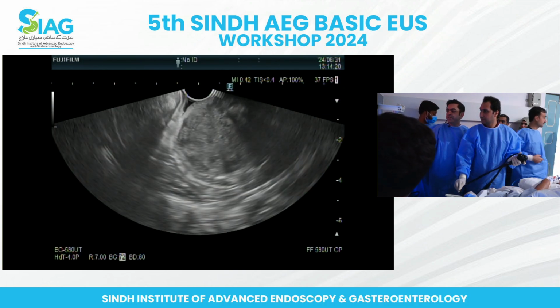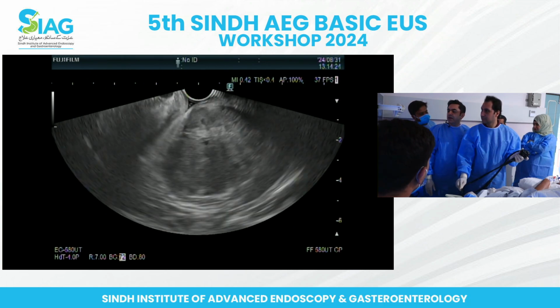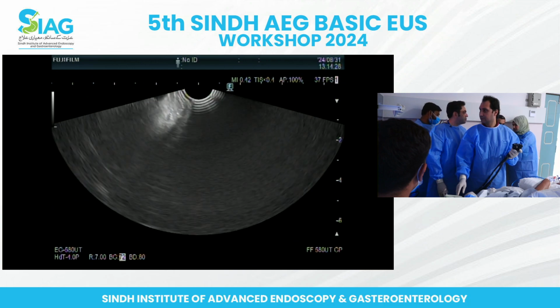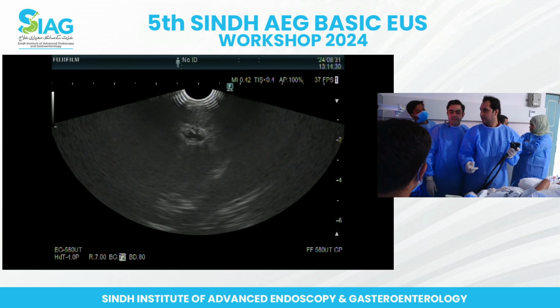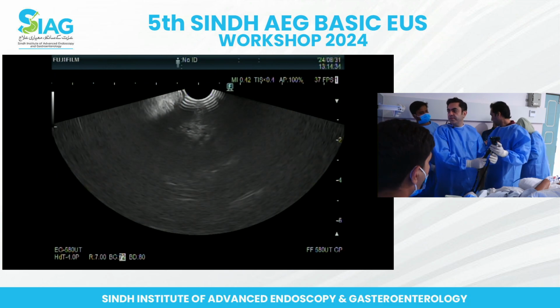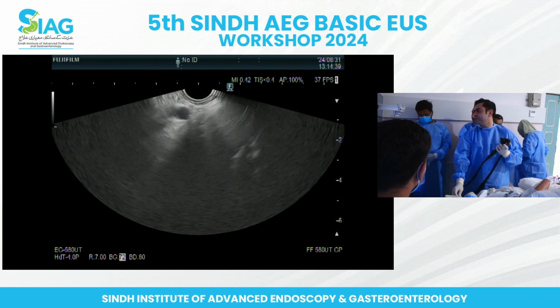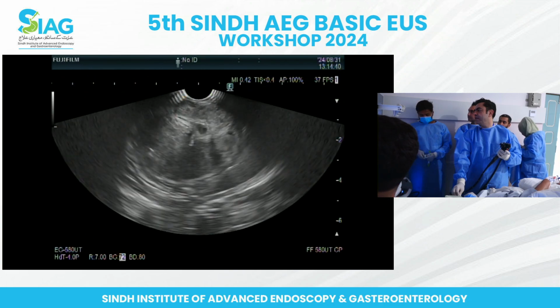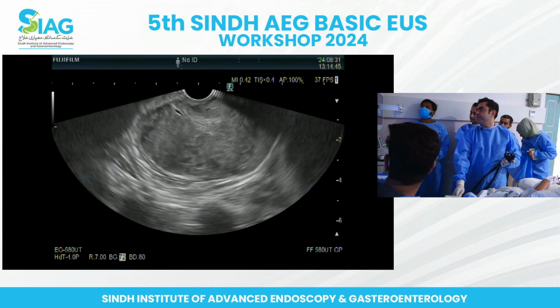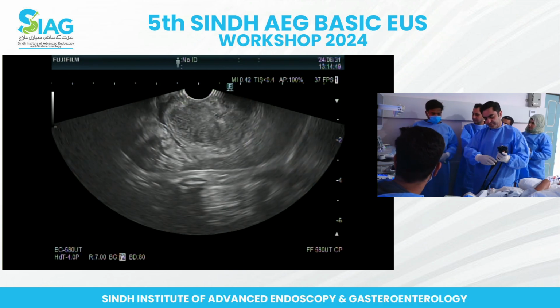Okay, that's fine. Thank you. Ready? I'm guessing this is a stable position. Yes, that is good. So I'll do it. Although I think you are much capable of doing the biopsy as well. But Shahzad, you finish the case. Okay, I'm just trying to take the biopsy and then we'll finish. Thank you. Give me the biopsy also.